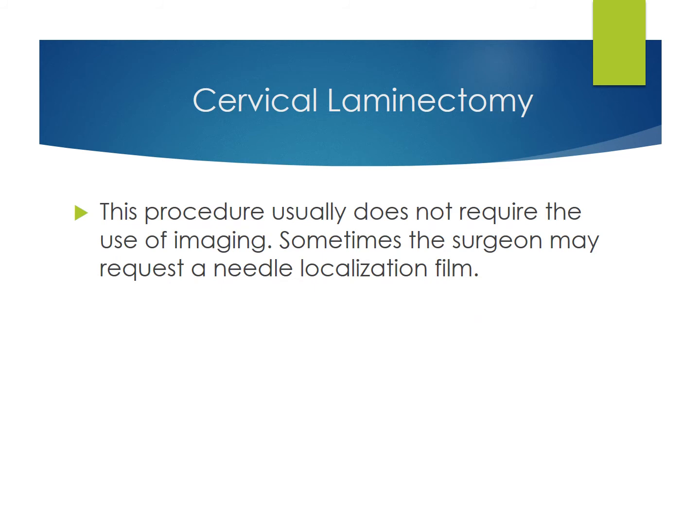Cervical laminectomy. This procedure usually does not require the use of imaging. Sometimes the surgeon may request a needle localization film.